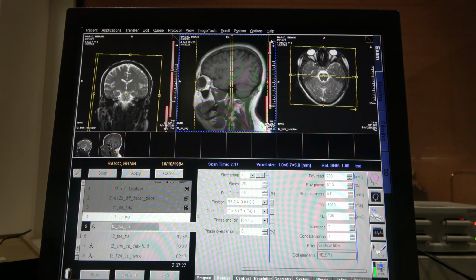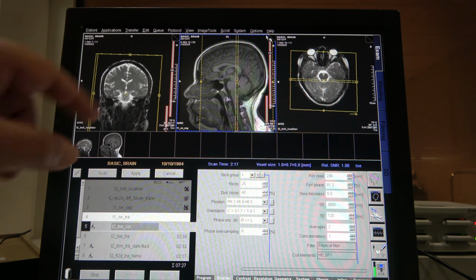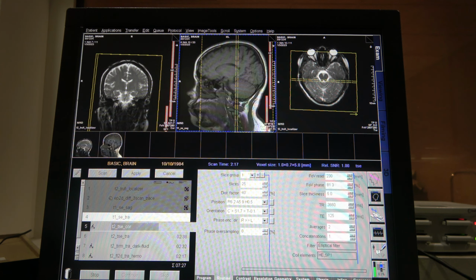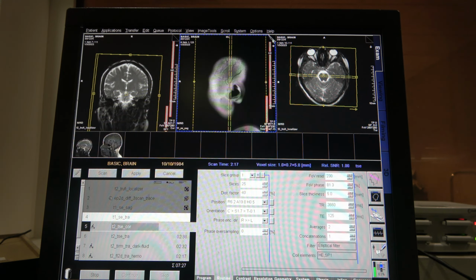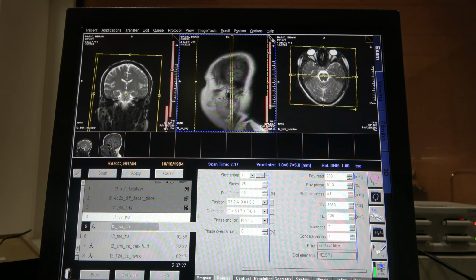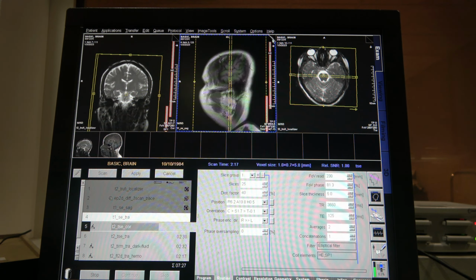All right. Now, if we were like this, we see that we are cutting off here. Okay, see that? All right, so we can add images or we can just move it, and make sure that front to back. I like to go 2 times. One, I'm just looking at the back of the brain here. All right, it's inside. Then I like to look at it again, and I look at the front. All right, everything's in there.